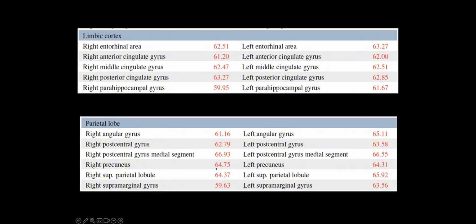The precuneus, again, another important area affected by Alzheimer's disease, is a solid decade older on both sides compared to this individual's chronological age. And this individual did have a traumatic event with a motor vehicle collision. And so to see this accelerated aging is super important because it suggests that this person is at a future higher risk of Alzheimer's disease, because Alzheimer's disease is subsumed in its risk by aging, and this individual clearly has accelerated brain aging, particularly in areas that we know based on the neuropathological literature are vulnerable to Alzheimer's disease.